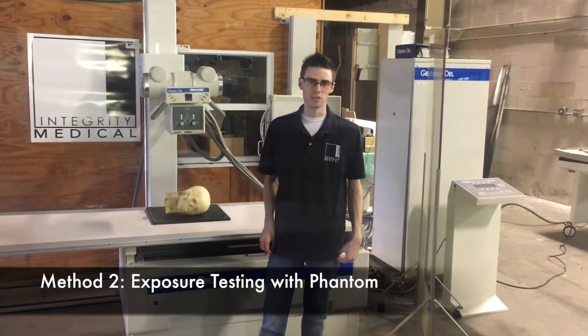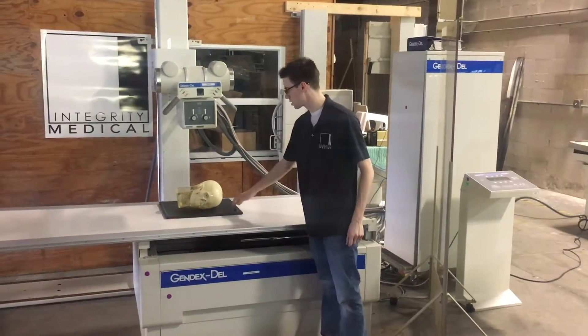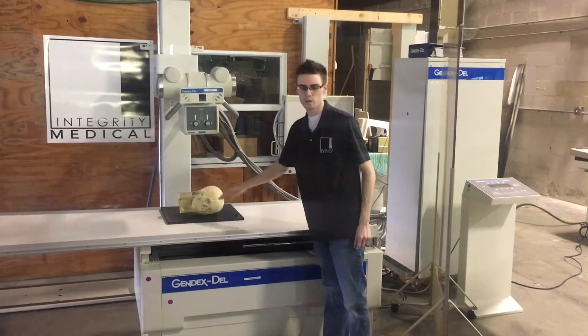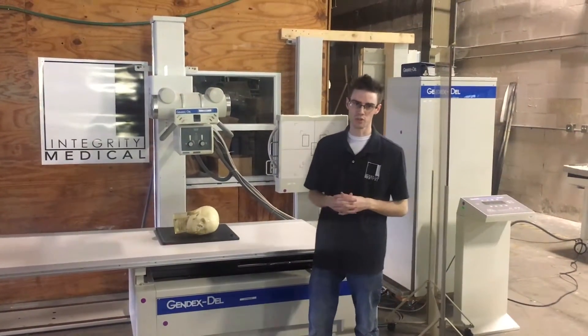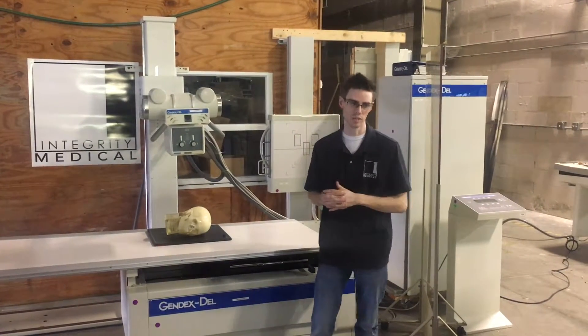Another method we use to make sure that the machine is working properly is that we put an actual cassette in front with a phantom. We're going to use the skull phantom for this one. We're going to make an exposure, put the cassette into a cassette reader, and make sure that the image shows up.